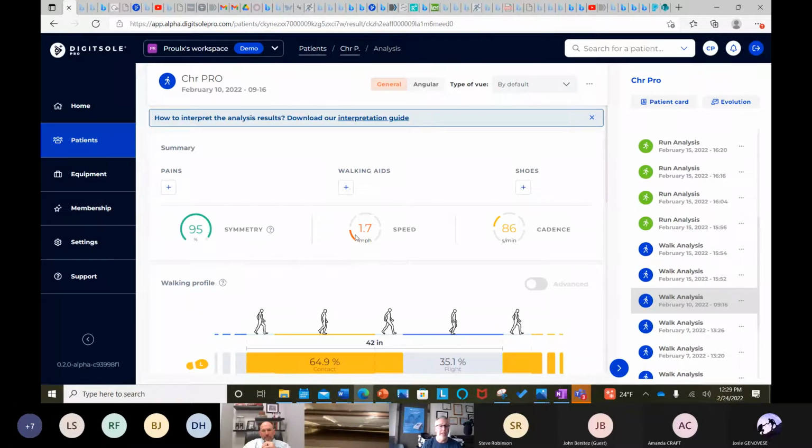When you see it in the red, as you see down here, so it's at 1.7 miles per hour, it's in the red. The reason is because the normative data, when you ask a patient to walk at a relatively comfortable pace that gets you to where you're going, is estimated to be approximately 3 miles per hour. That's also associated with the metabolic equivalent, your MET values, for if you are going to say to someone, go ahead and walk, as your steps, your level of physical activity to obtain the necessary amount of physical activity on a daily basis. That's a good thing.